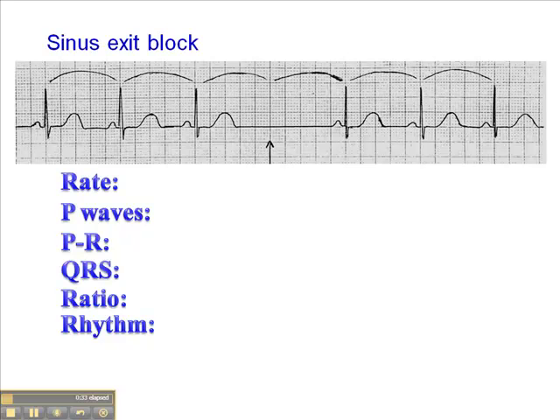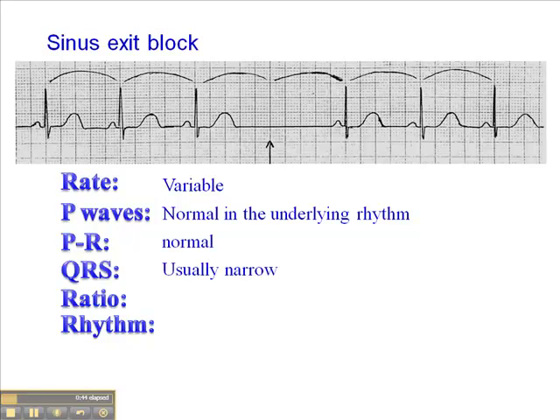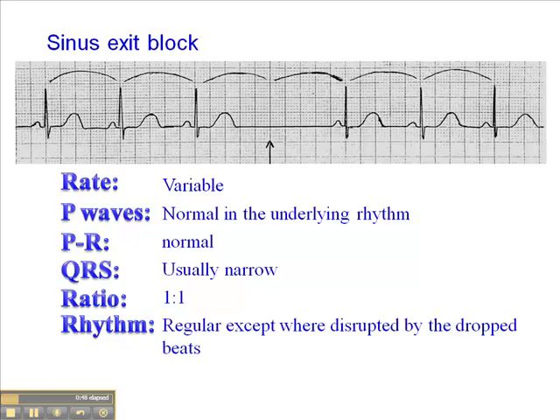Sinus exit block is fairly rare. The rate in sinus exit block may vary. Typically, the underlying heart rate is normal, and P waves are normal in the underlying rhythm. The PR interval will be normal, QRS is narrow, and the ratio is one to one. The rhythm is regular except where disrupted by the dropped P wave. The underlying rhythm is sinus — we see a P wave and a QRS, and then we see this pause, much like the pause we saw in sinus arrest or sinus pause.